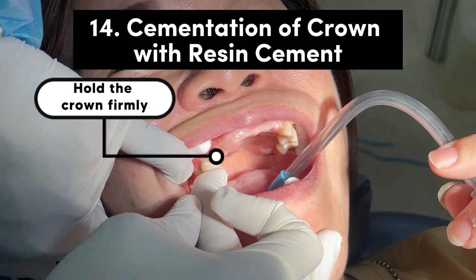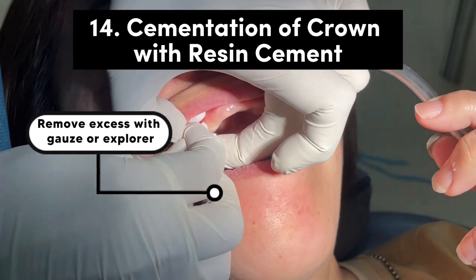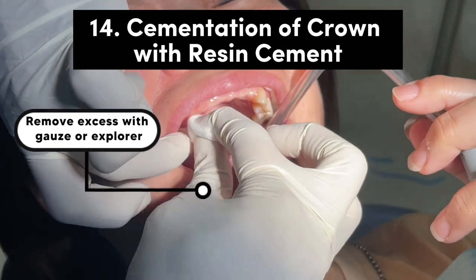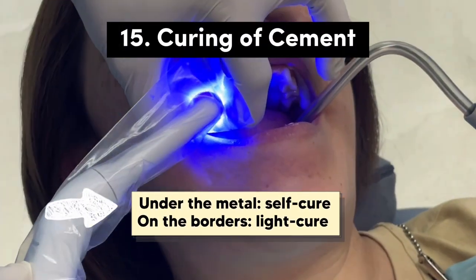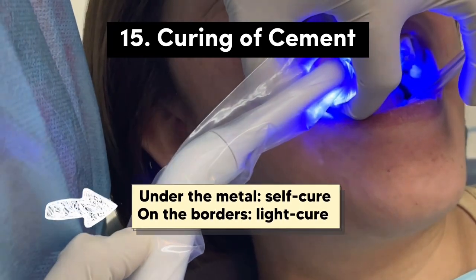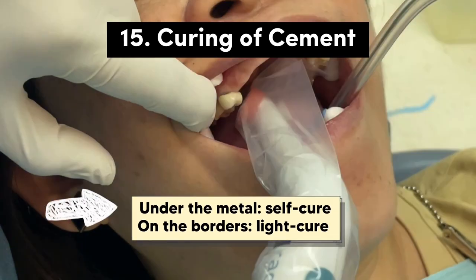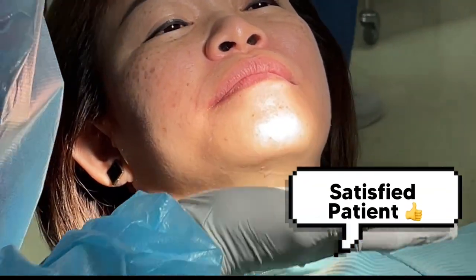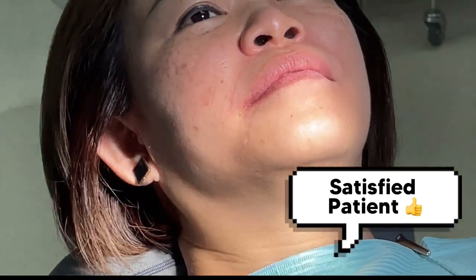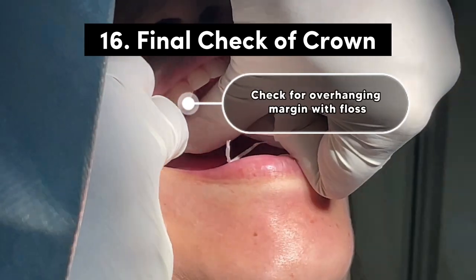Always make sure to hold the crown once it is seated with cement inside; otherwise there are high chances it can rebound. Remove excess cement with gauze or an explorer tip, and make sure floss can easily pass between the teeth. Since this cement is dual-cure, the area under the metal undergoes self-curing, as light cannot pass through metal. On the borders, apply light cure all around. We reinsert the removable partial denture and ask the patient to bite again. We check the occlusion to confirm it has not changed after cementation. The margin of the crown adapts well to the tooth preparation margin. Once satisfied with occlusion and fit, you give post-insertion instructions to the patient.